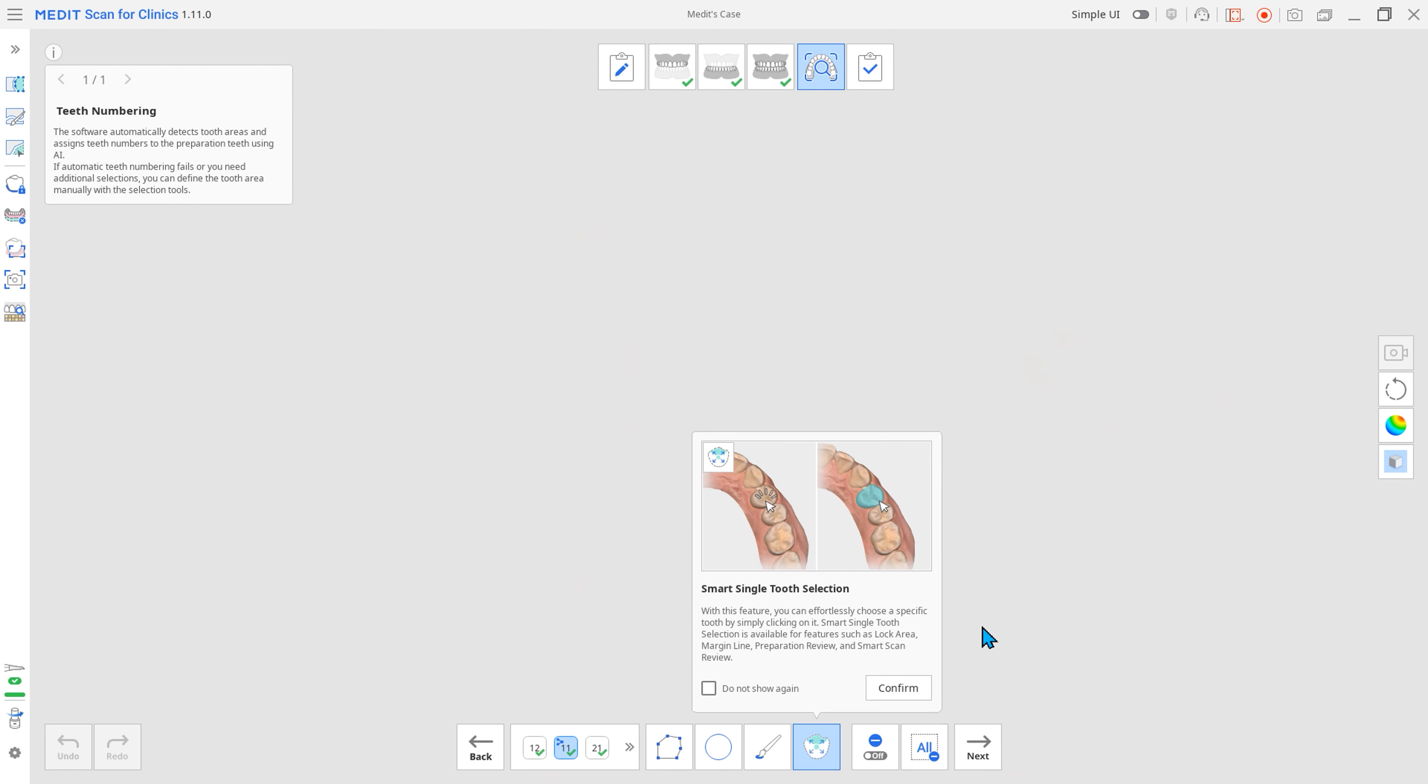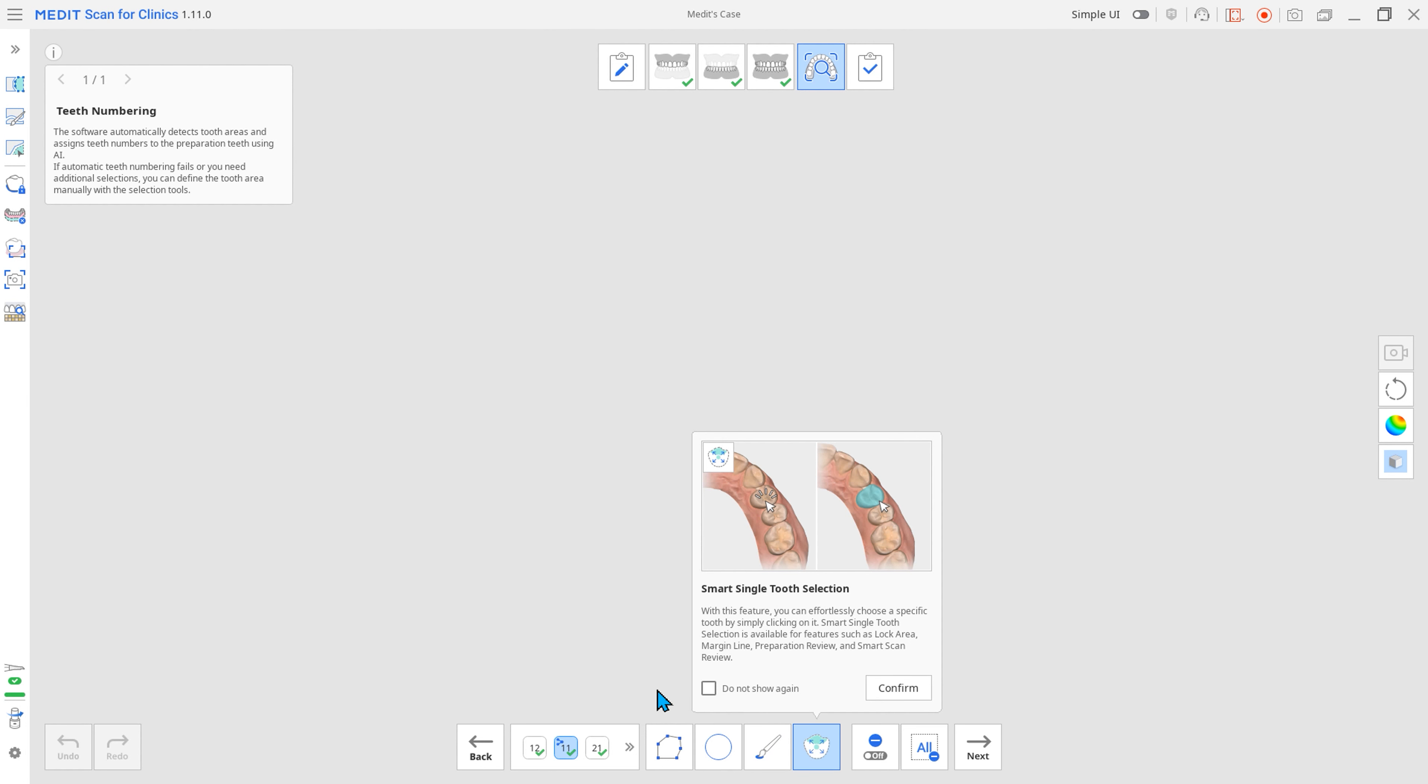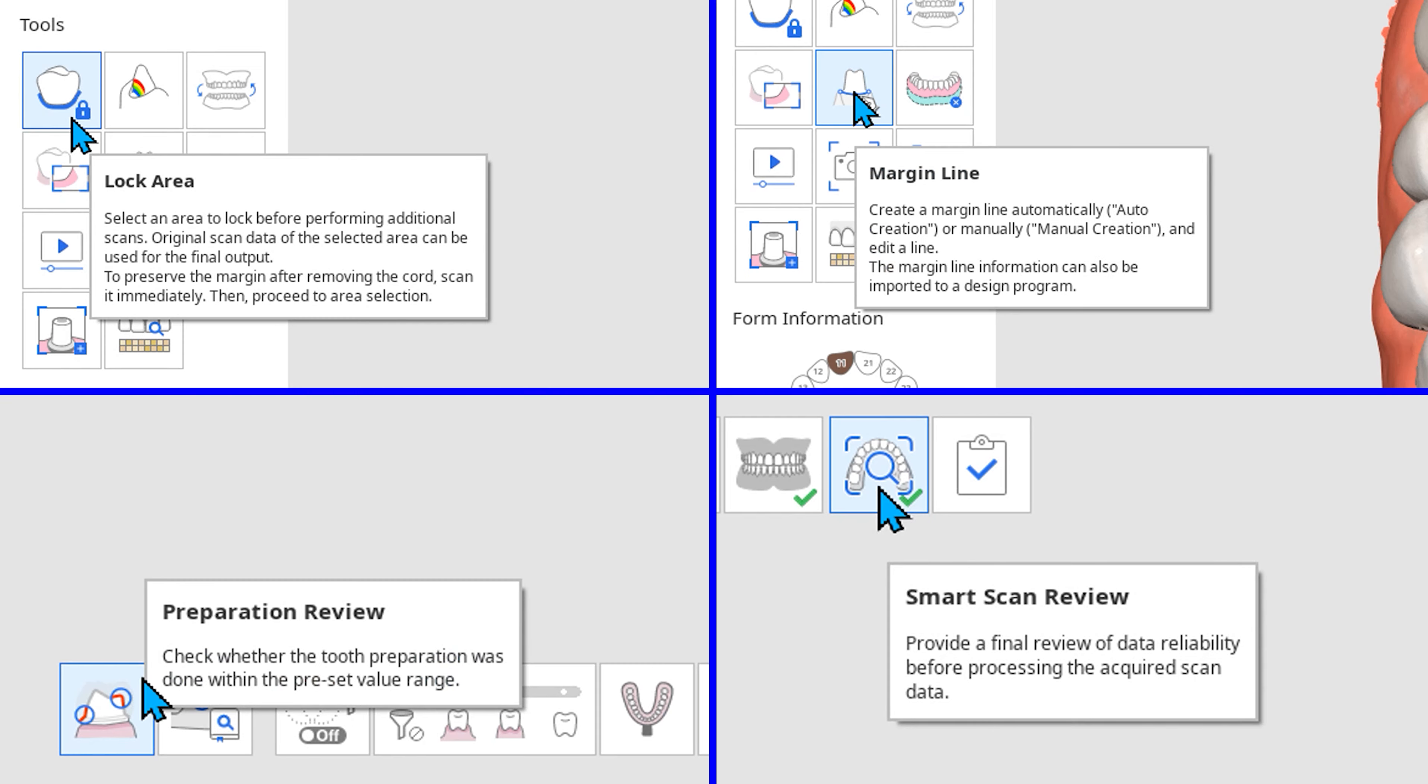This update also includes Smart Single Tooth Selection. You can select the tooth area with a single click without using selection tools. This feature can be used for lock area, margin line, preparation review, and Smart Scan Review.